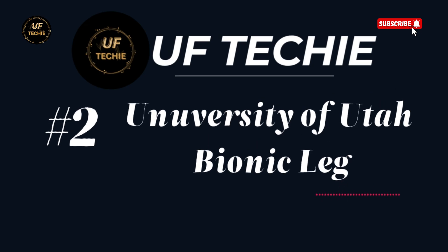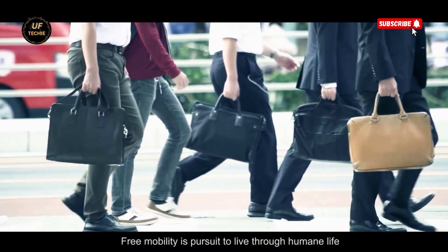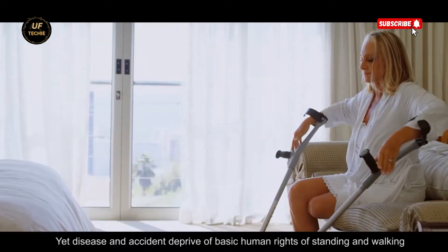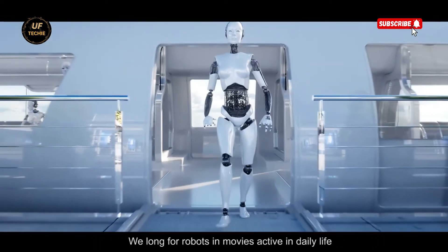University of Utah Bionic Leg. Walking on two legs is something most of us take for granted — a basic human function that gives us independence, freedom, and dignity. But for millions around the world, injury, illness, or congenital conditions strip away that simple ability to stand, to walk, to move without assistance.